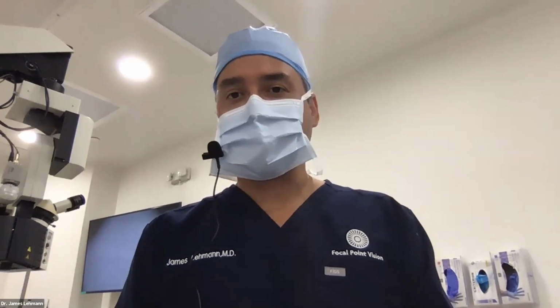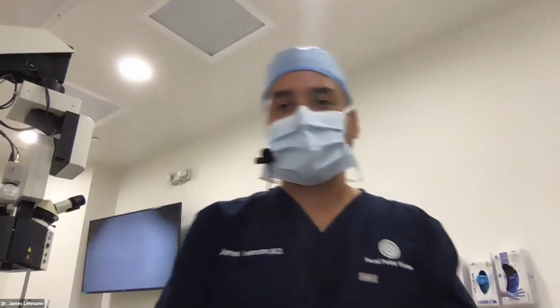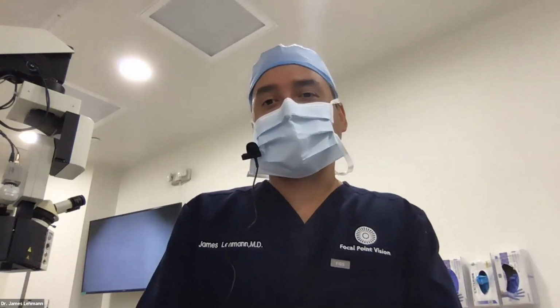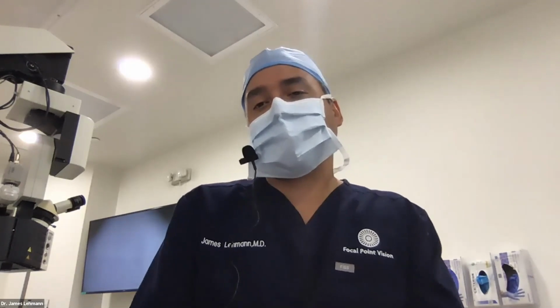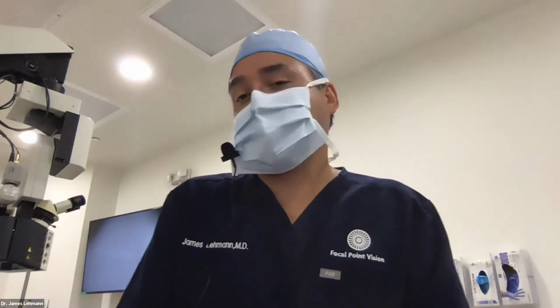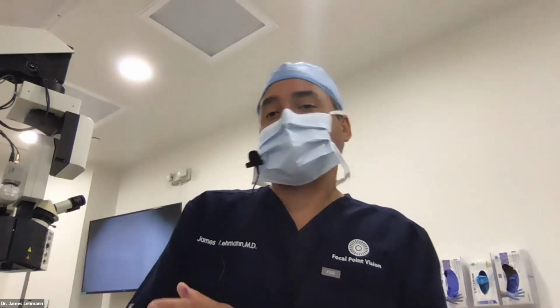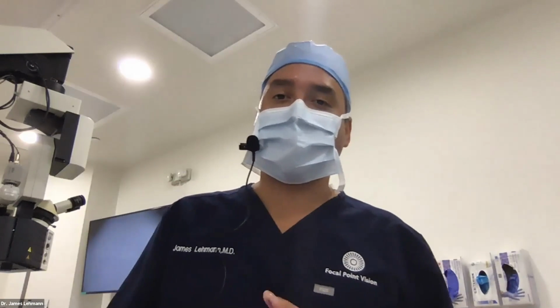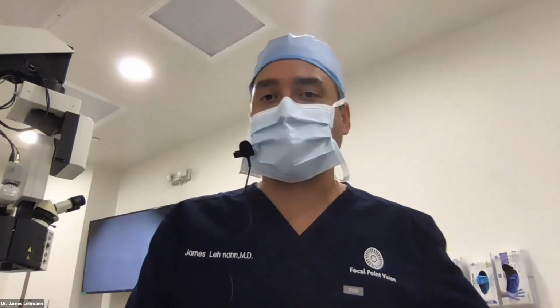Next one. Do you consider preoperative specular microscopy in a patient with dense brunescent cataract? I don't think so. I mean, they're going to need the surgery in that case anyway. If you don't see obvious guttae, you can tell them that the odds are they're going to do well. You could also consider doing small incision cataract surgery if it's really dense. In a lot of developing countries, people have experience with that, and so that's going to be easier on the endothelium than phaco.